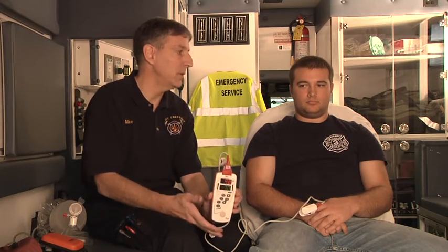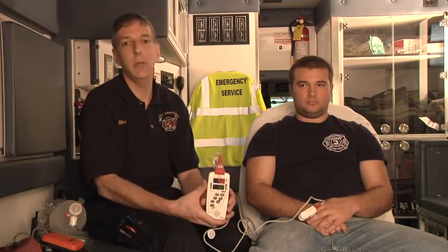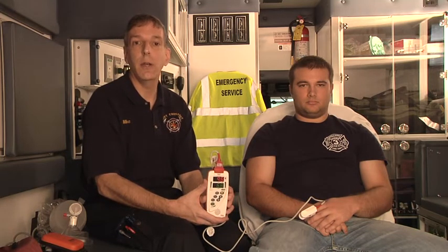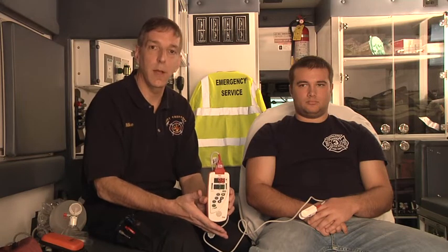One of the changes in the American Heart Association Guidelines 2010 has to do with the use of an airway in a patient. In a patient who's spontaneously breathing, there is not a great value in using an oral or a nasal airway unless you're having difficulty ventilating the patient.